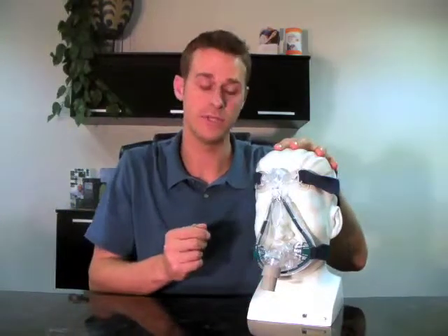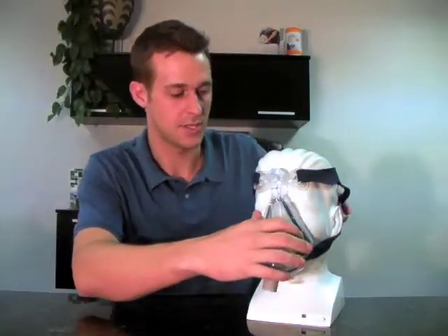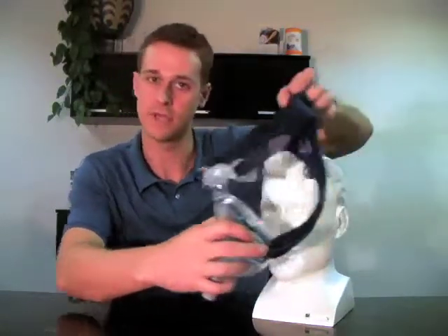The first thing we're going to do is actually disassemble the mask and show you the different components, which are frequently replaced and often are replaced on different schedules.